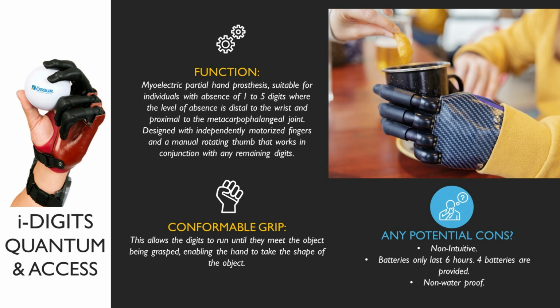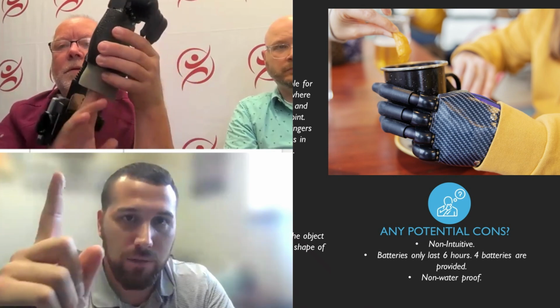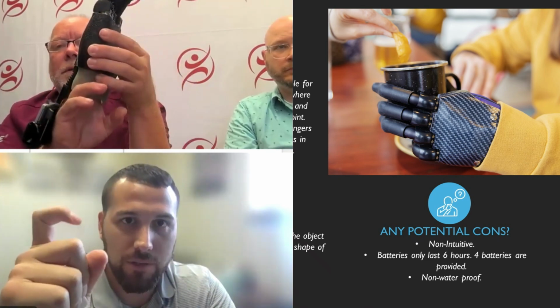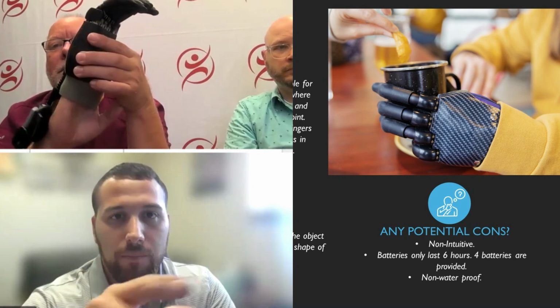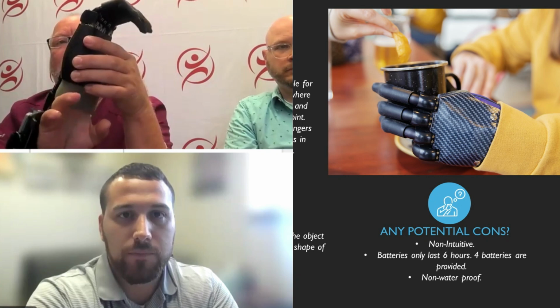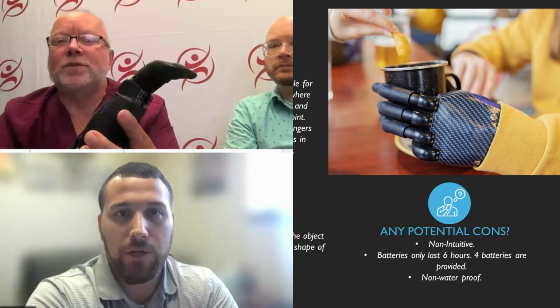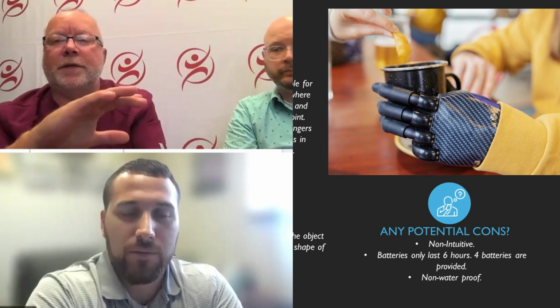Okay. Mike, tell me a little bit about how those fingers operate. So obviously you got the electrodes in there, and those are placed specifically by us inside the socket. With the PIP driver, they're just essentially still doing this. An MCP driver. How do these function? I'm not sure what your question is. How do you achieve open and close on that device? Oh, that's where the electrodes are.